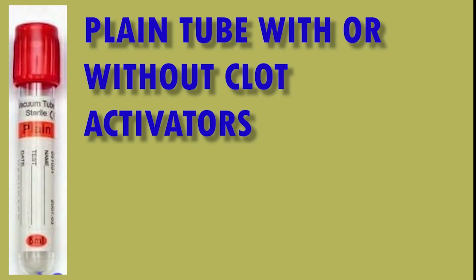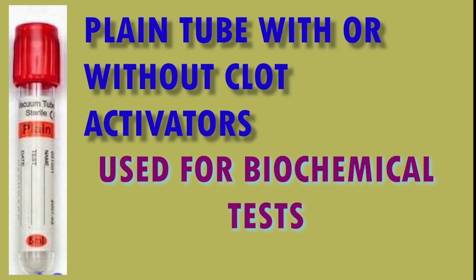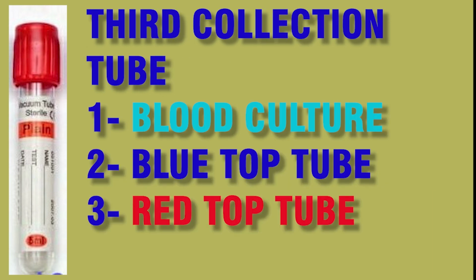The next tube is for chemistry studies, the SST tube or the red top tube. These tubes contain clot activators and the sample is expected to clot fast so that the serum is separated and analyzed within a short time period.